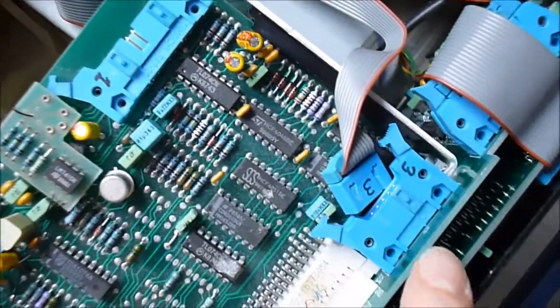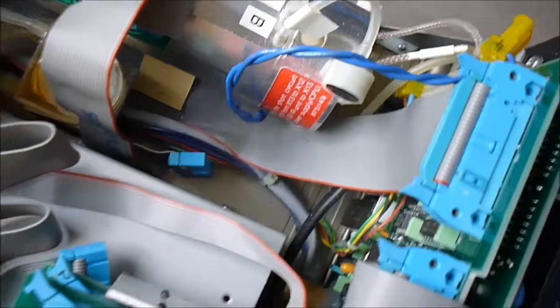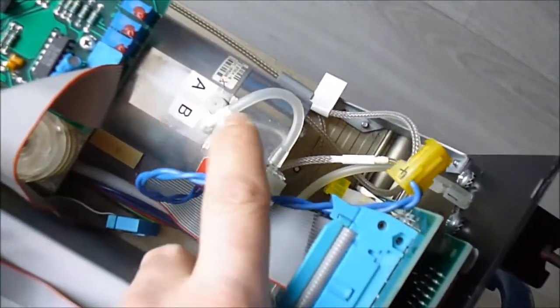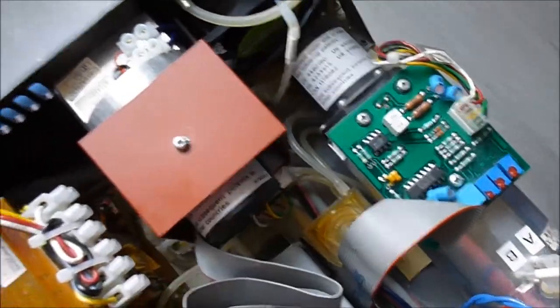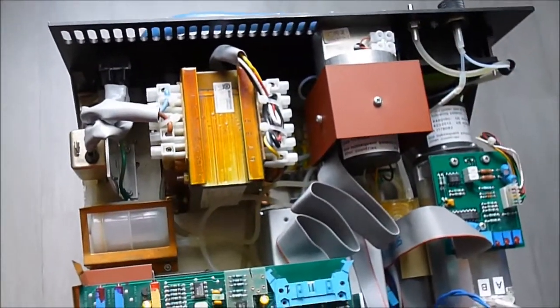So as I must take everything apart, I did label the plugs and connectors in order to be able to reassemble it with no issues. I do the same thing for the pipes, but with letters. So the next step will be to remove these two instruments. I just wanted to show you what it looks like when it is opened completely.